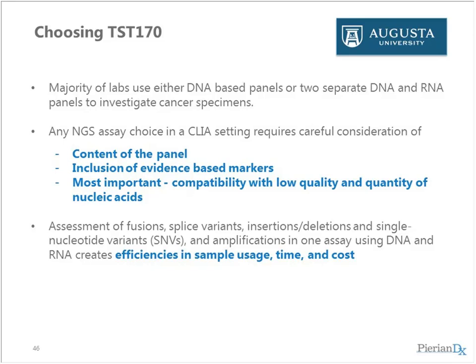And for me personally, I think it's very important that these panels are compatible with low quality DNA and RNA, because as a surgical pathologist, I usually look at these slides, identify the region of interest on these H&E slides, and isolate the nucleic acids. And most of the time in the past, they have not been compatible with the assays we had on the NGS platform.